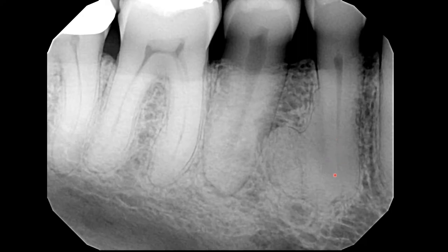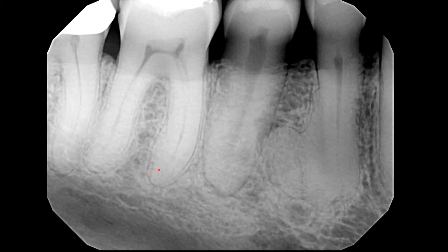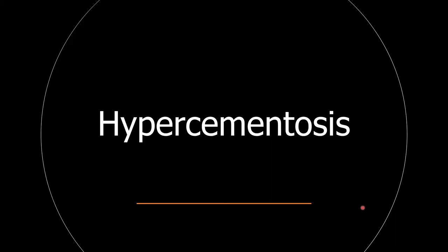The root does not appear to be resorbed. The second premolar is slightly distally displaced. A similar but less pronounced finding is also seen on the mesial root of the first molar. You must have figured out the diagnosis of the mass as hypercementosis.